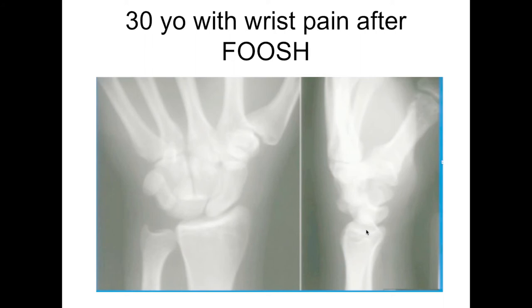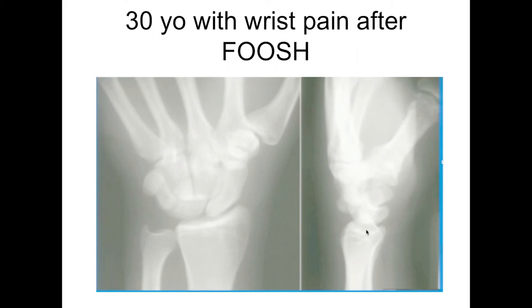Another case: a patient with wrist pain after a fall. This is hard to see, but the proximal row — the scaphoid, lunate — they're all impinging on the capitate above. So you can't draw that C over here, indicating pathology. When you look on the lateral view, here's your lunate — the cup — it's still making contact with the radius. Everything above it is not stacking up. What is this injury? It's a perilunate dislocation. The lunate is not dislocated because it's still in contact with the radius.